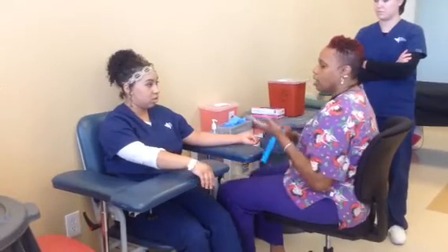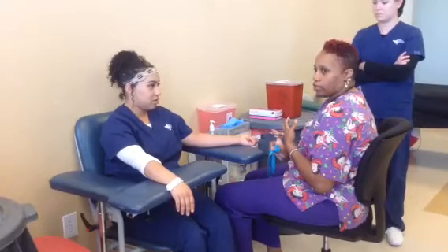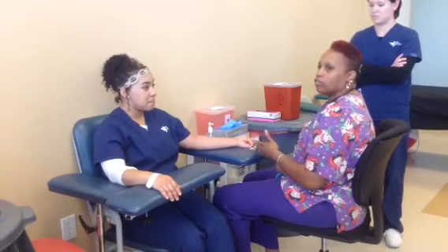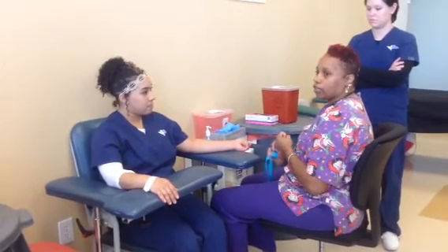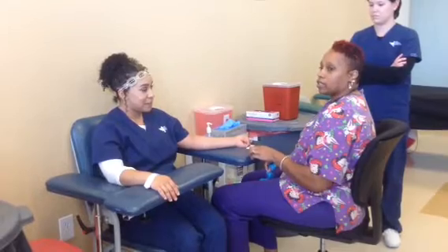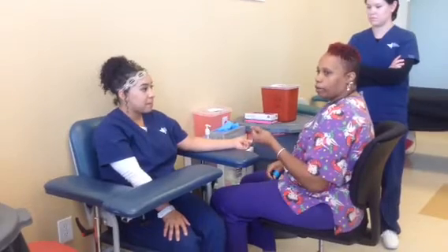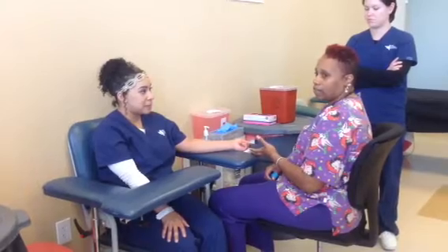Then the three questions: Are you allergic to latex? Have you ever passed out or fainted when giving blood? Are you right-handed or left-handed? It doesn't matter which order you ask them in — that you ask them is the important thing. The reason I ask are you right-handed or left-handed is because I prefer to try and stick in the non-dominant arm first. Because if you stick in the dominant arm, people get up, grab a purse, open a door, start using it immediately.